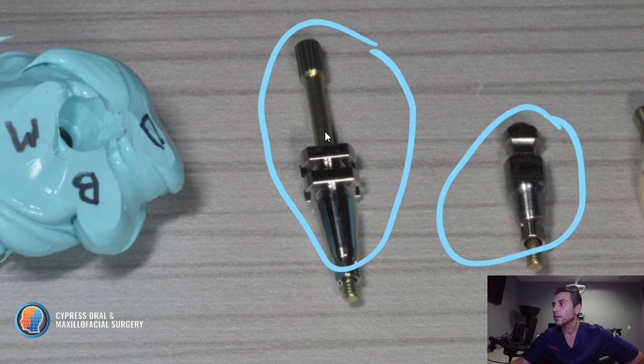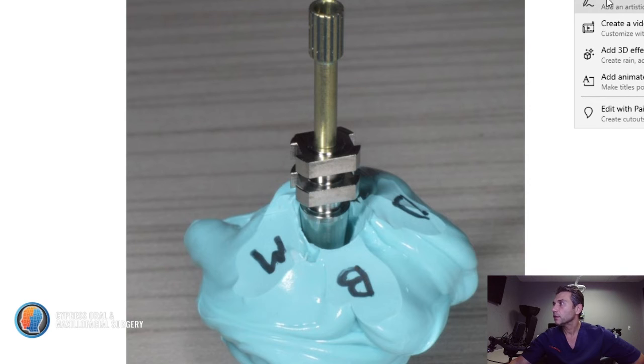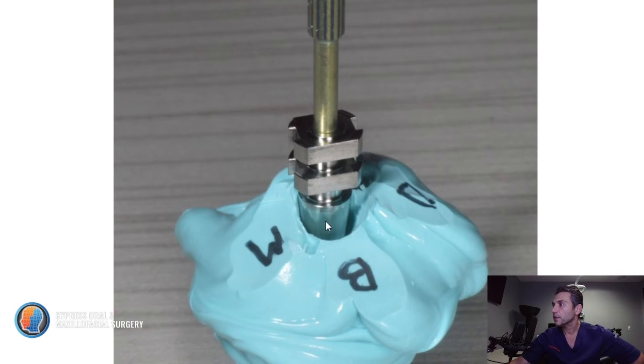And what you do is you take this and you screw it in here. Again, not very tight. Just finger tight, very loose. And now you have the open tray impression coping in the analog, and you can see the space. There's space between where the gum is and where this is, and we're going to fill this area here and even back here if you can with composite.